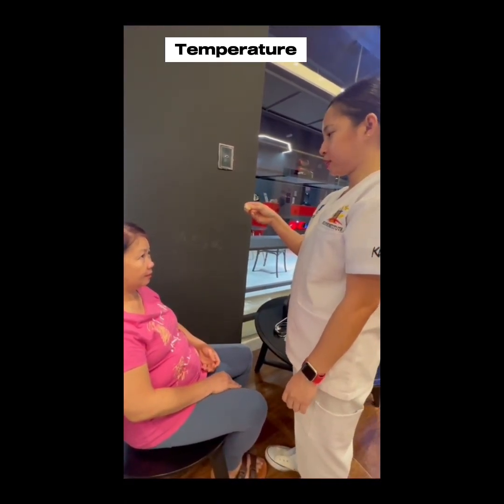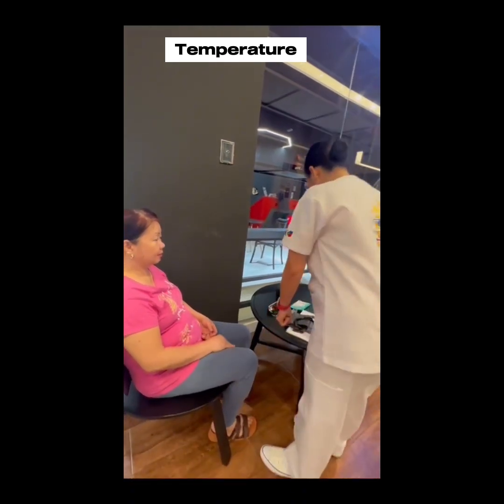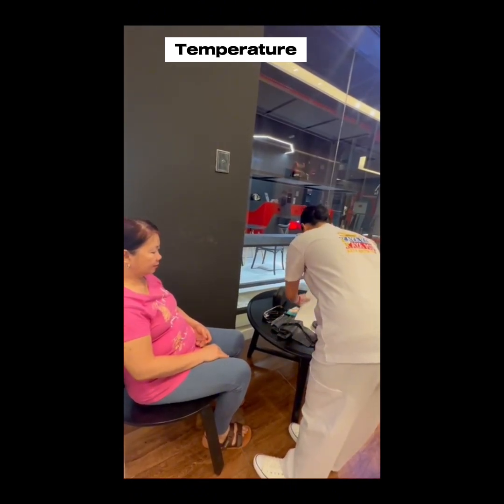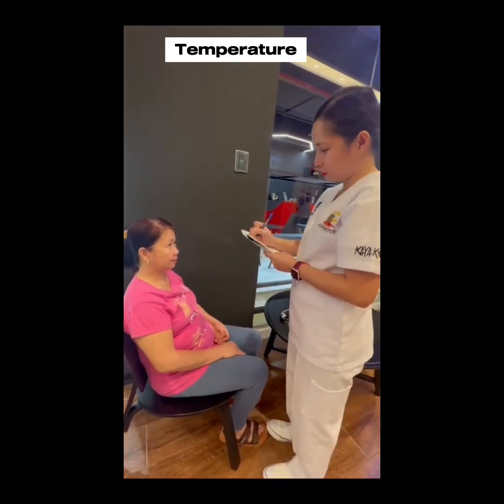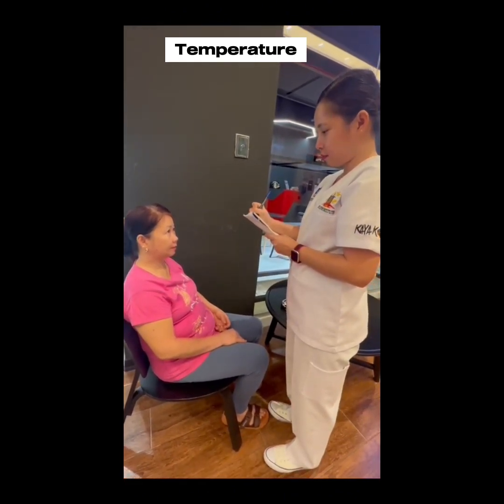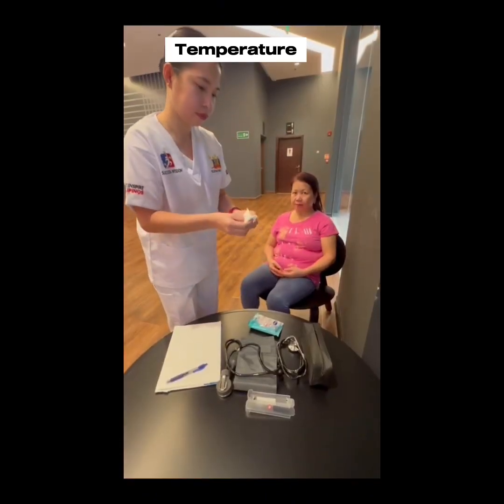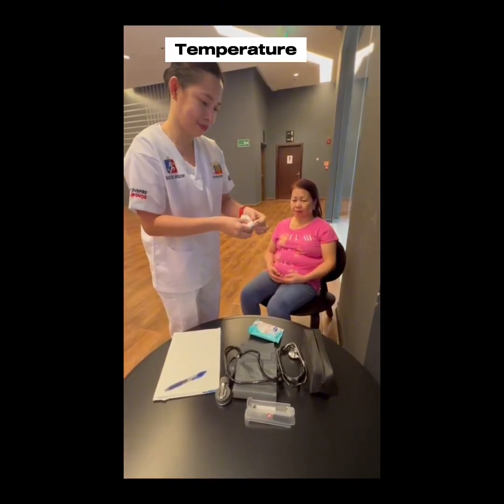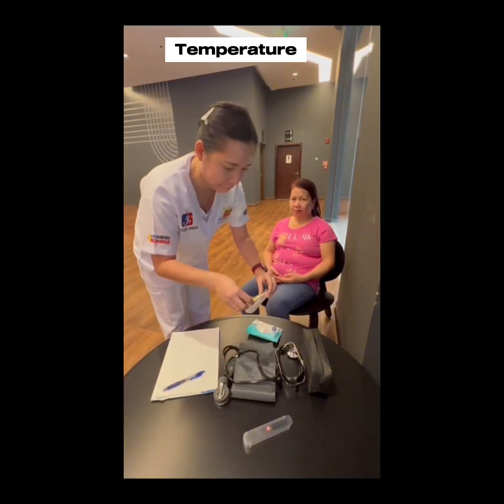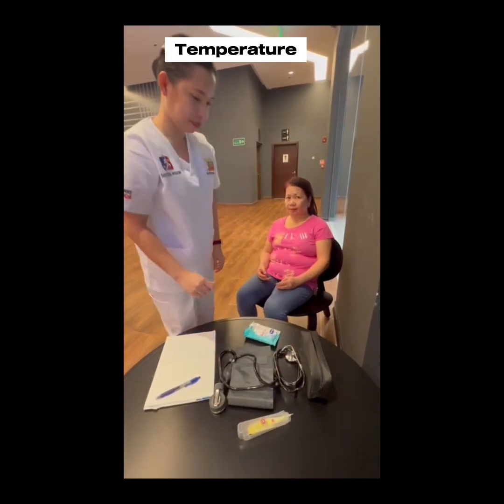Remove the thermometer and read the digital display. This allows an accurate temperature reading. Inform your patient of his or her body temperature. Clean the thermometer using an alcohol swab before placing it back. This is to prevent the transmission of pathogens and microorganisms. Place the thermometer back in the holder and keep it securely until the next use.